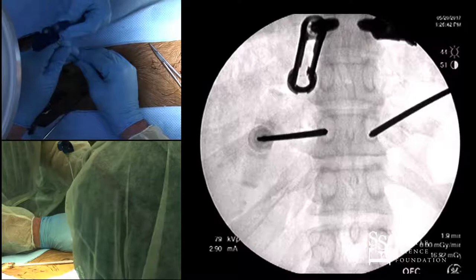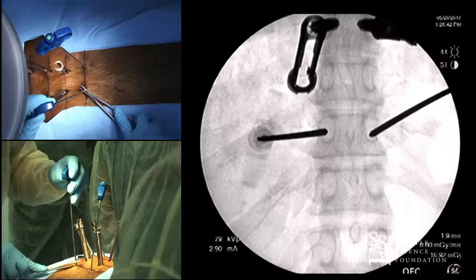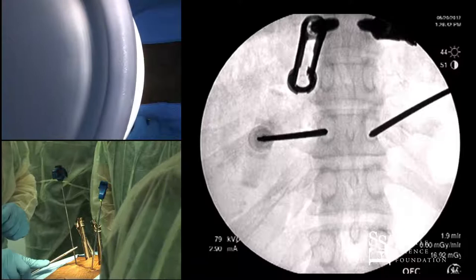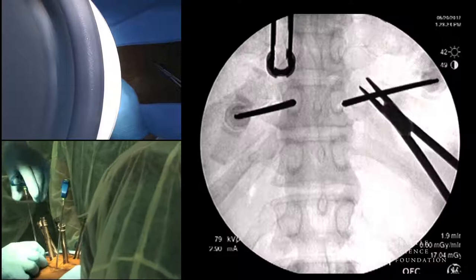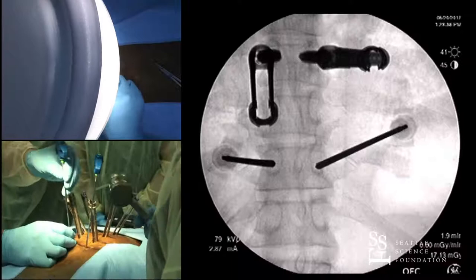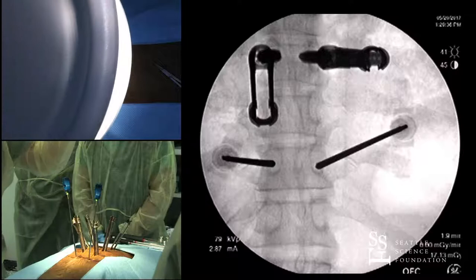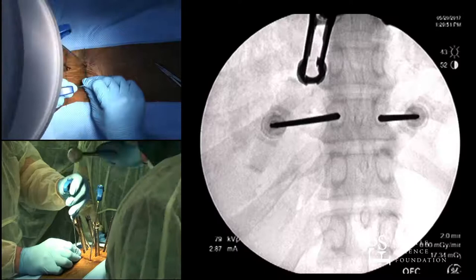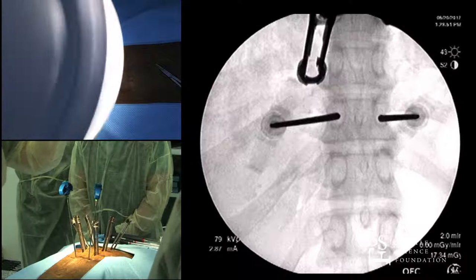Three o'clock and nine o'clock starting positions — and I'll converge them. You can see Andrew's working its way across. I'll stay in the AP and go down to the mark I made outside the skin. I'm a little concerned about the one on my side because I'm already into the middle of the body and I've barely gone in — so I'm going to make an adjustment. It's just a Jamshidi needle so far, about two to three millimeters. I didn't converge as much, so I'm still not past the midpoint.